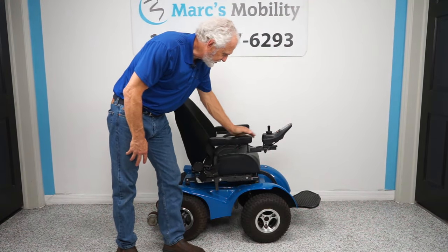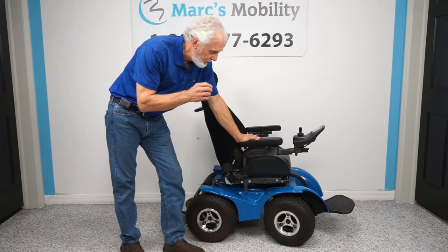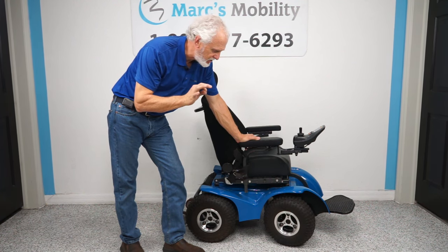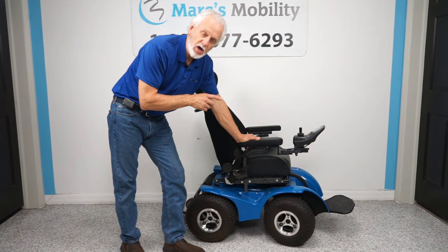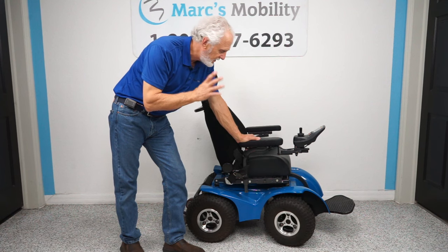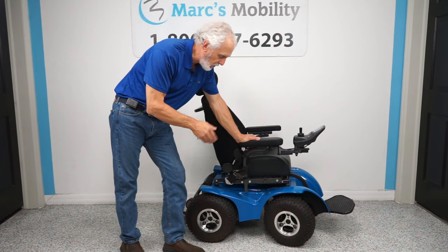We have a chair that a lot of people are always looking for — this is a Magic Mobility X8, the Extreme A. This chair is a four-by-four power chair with four motors, 700 watts per motor, giving you 2800 watts of power total. You have more than enough power. This thing will do incredible stuff — this chair will go on the beach because it pulls from all four wheels.